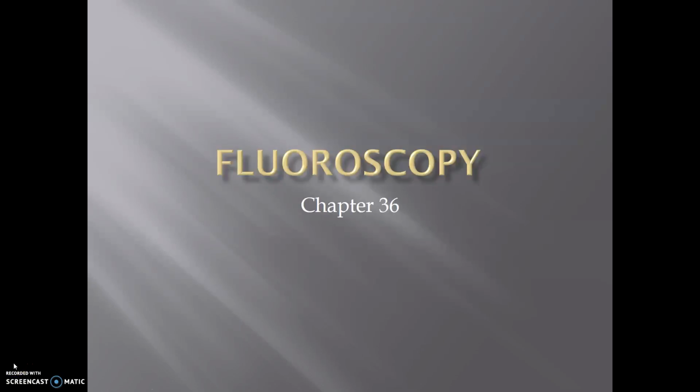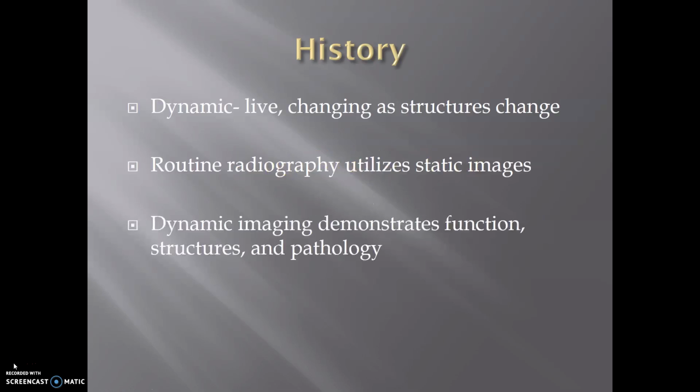Today's lecture will cover fluoroscopy. Fluoroscopy provides dynamic, live imaging, which shows changes as structures change. Routine radiography utilizes static images, whereas dynamic imaging demonstrates functions, structures, and pathology.